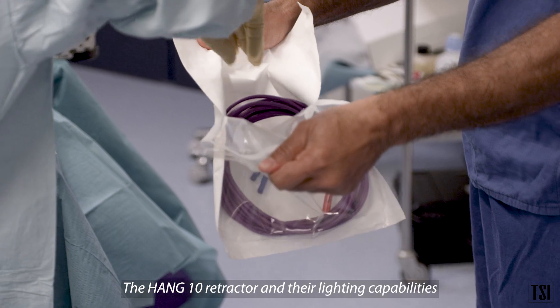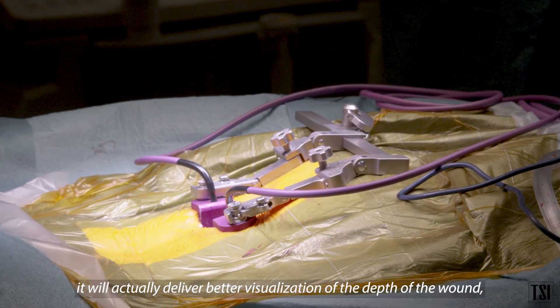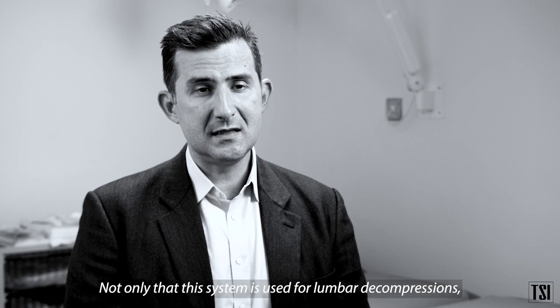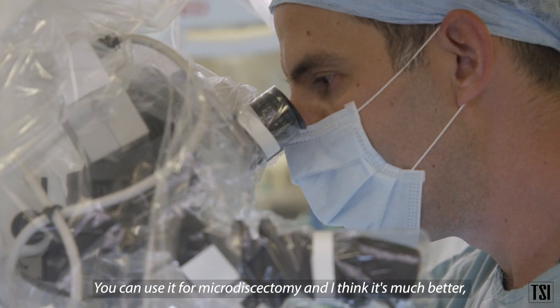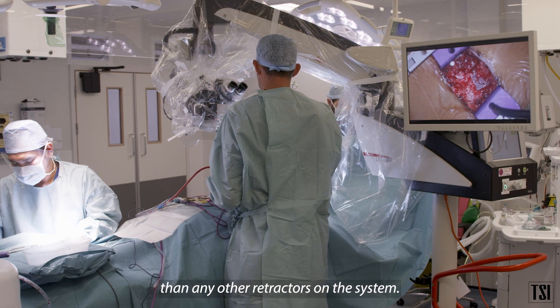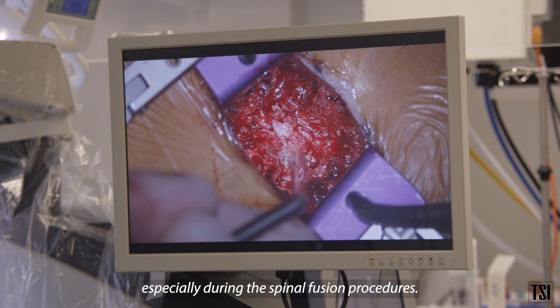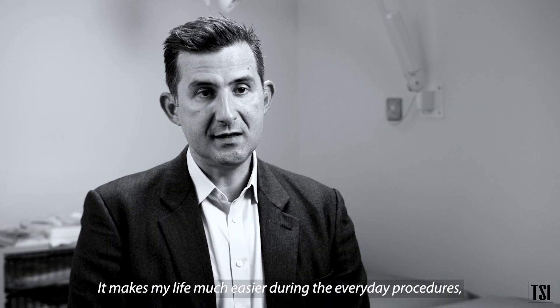The HANG 10 retractor's lighting capabilities remove cross-shadowing and deliver better visualization in the depth of the wound compared to older-generation products on the market. This system is not only used for lumbar decompressions and lumbar fusions — you can use it for microdiscectomy as well, and it gives much wider exposure over the laminas and facets than any other retractor. The design is perfectly suited for placing cortical screws, especially during spinal fusion procedures. The HANG 10 has changed my clinical practice and makes my life much easier during everyday procedures.